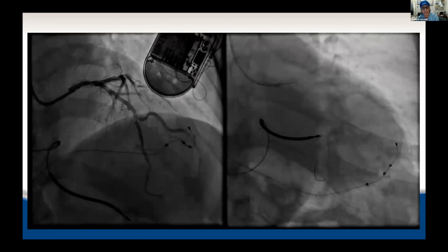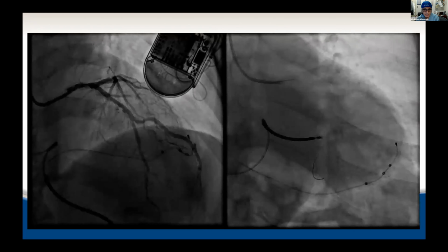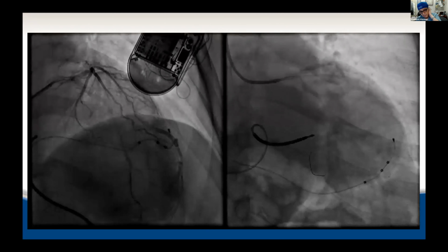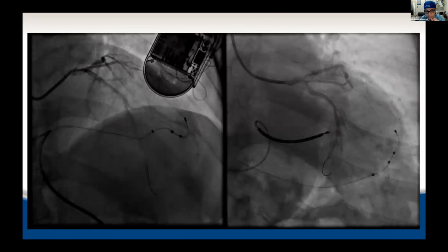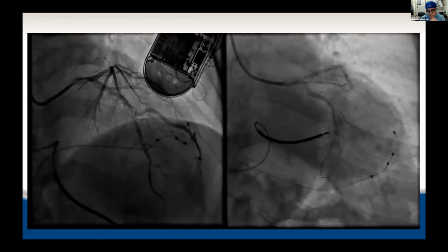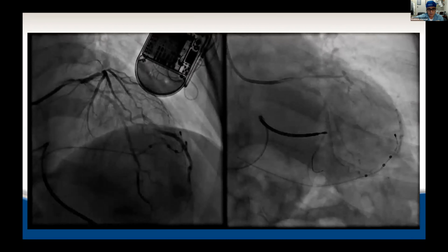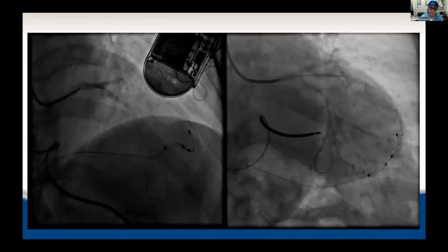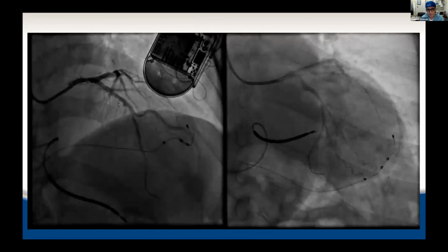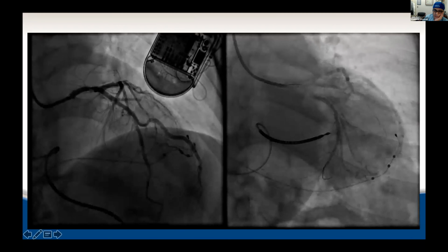Yeah, so I think when the vessel is bigger than 3 millimeter, I tend to reach for the CSI. The angulation just dictates my wire choice. So this is the Viper Flex tip wire, and which part of the wire I will leave in the lesion. So if you have a retroflex circ, or a severe angulation, there is a risk with the floppy rota wire that the rota can actually go straight and sever the wire. I tend to use the supportive rota wire in this situation, but both have their risks, both have their advantages. And they are a little bit different. And I'm starting to remember now what we did with this patient.